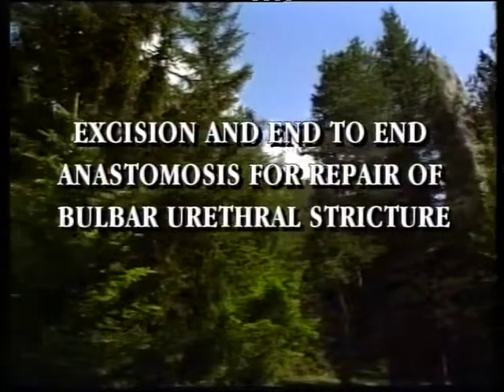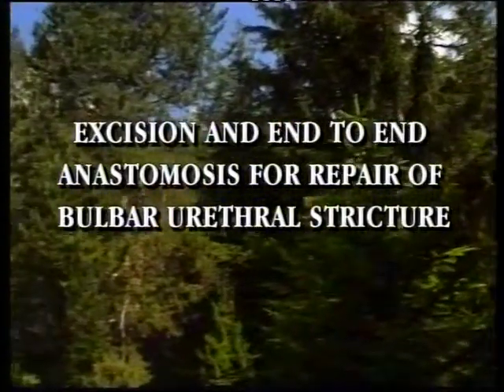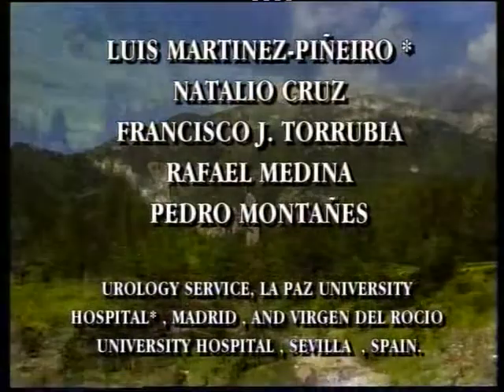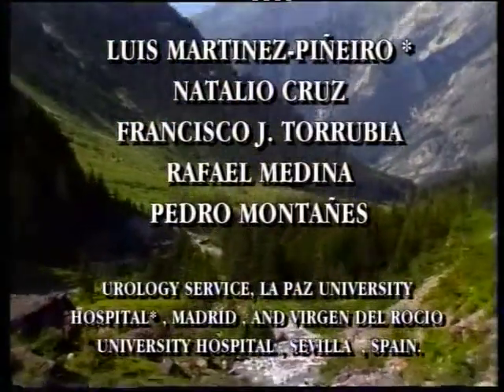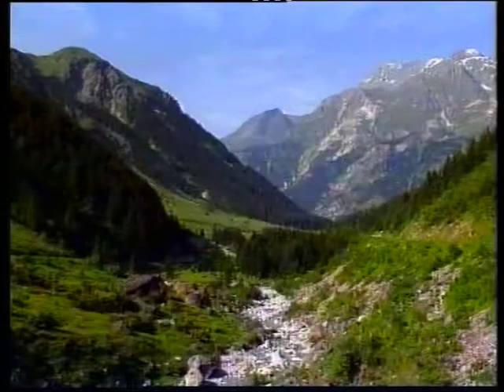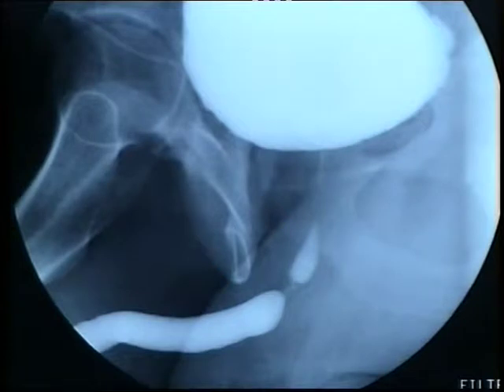We present a 19-year-old patient with an idiopathic urethral stricture. He never consulted his doctor and presented to the emergency room with acute urinary retention, which was managed with a suprapubic bladder catheter. Urethrograms show a 2 cm long deep bulbar urethral stricture.